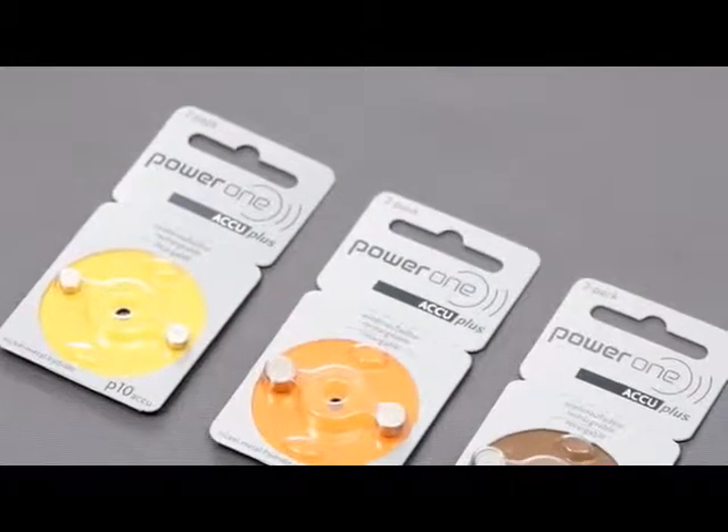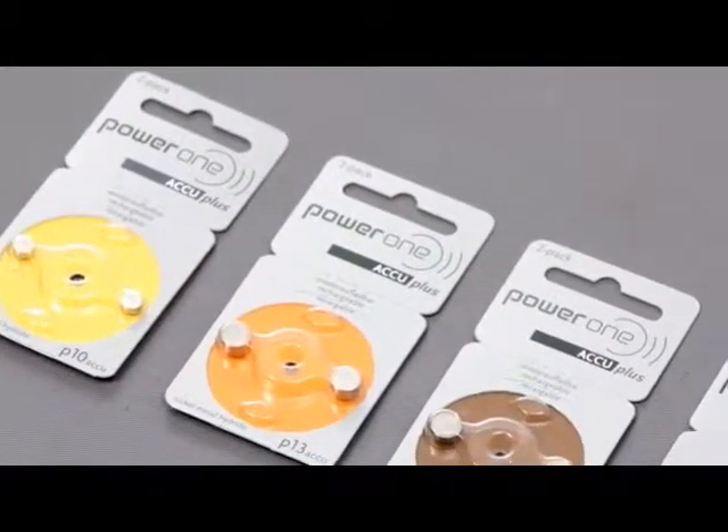Welcome to Power One. Mr. Zekler wears a hearing aid himself. Today he would like to present to you our rechargeable hearing aid batteries, Power One Accu Plus.